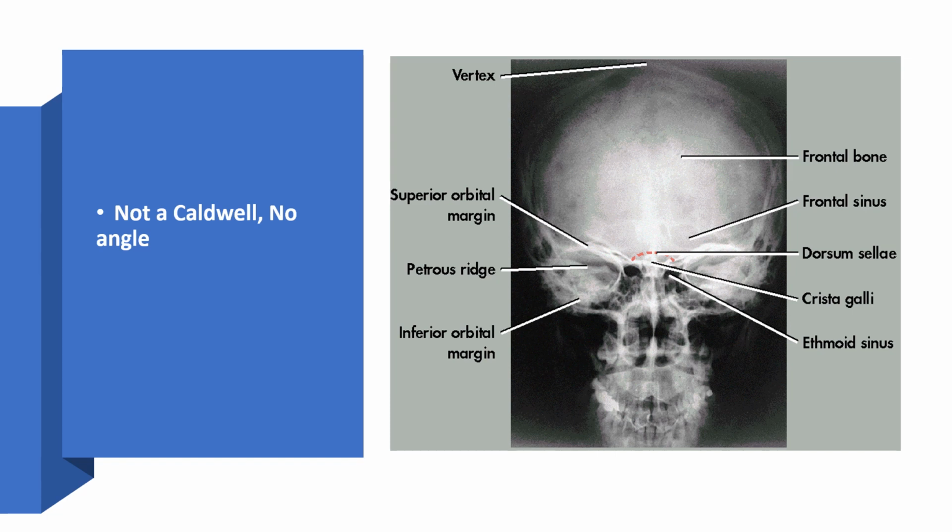Okay, frontal sinus is foreshortened a little bit on this projection. It's elongated a little bit on the Caldwell projection, so we get a better view of the frontal sinus on the Caldwell. The straight PA shows the frontal bone, the superior portion of the frontal bone, just a little bit better than the Caldwell projection does. Okay. So Caldwell projection is often looking at the frontal bone, looking at superior orbital margins.